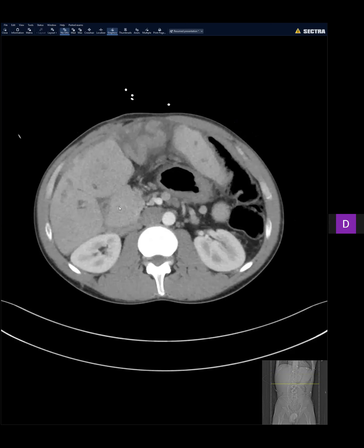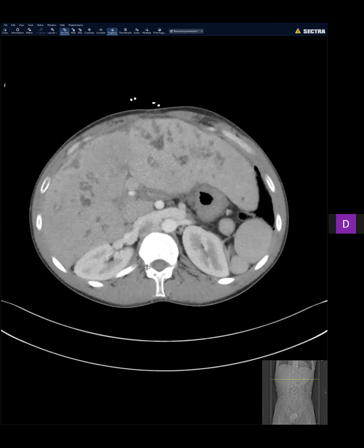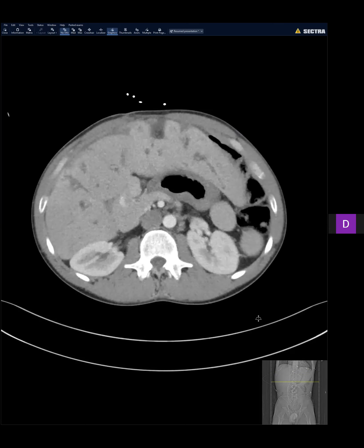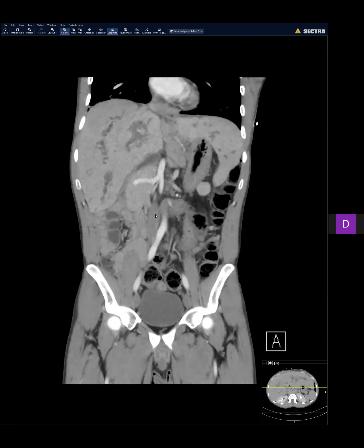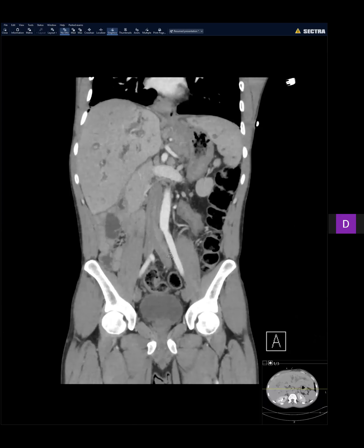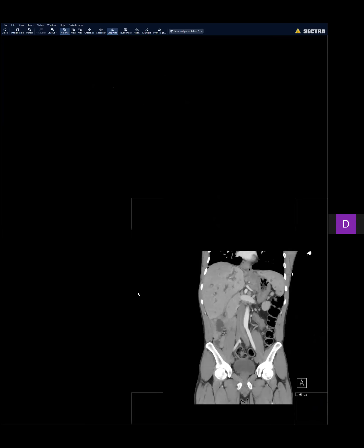The pancreas is just totally rotated to the right side. If you look at the vascular anatomy, you can see the SMA — this branch goes in here — and that's just pancreatic tissue. So there are a lot of manifestations of heterotaxy.